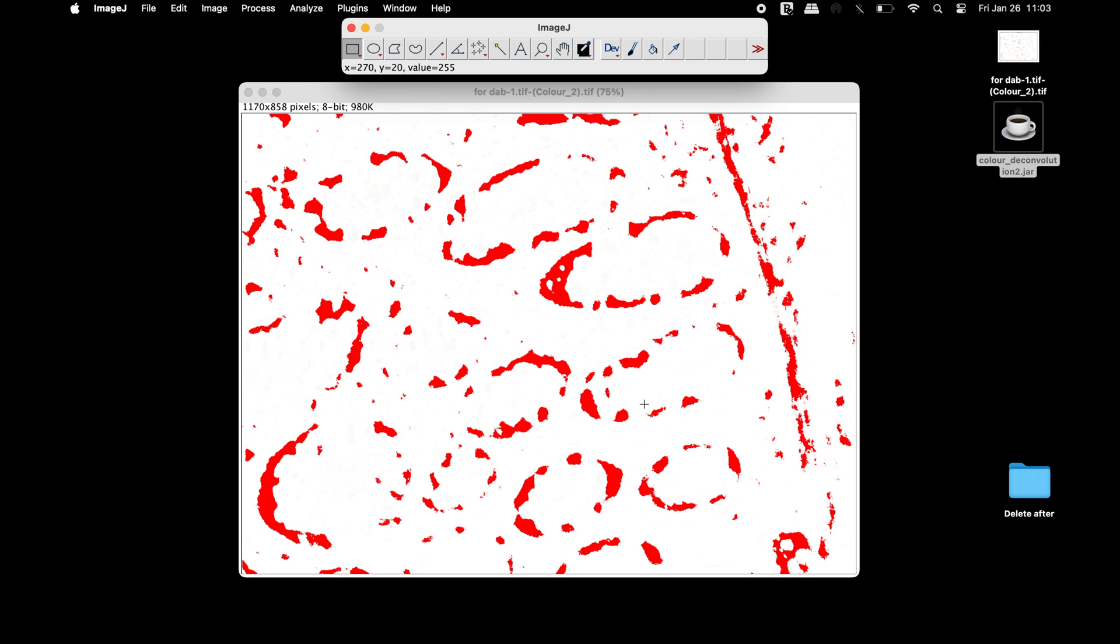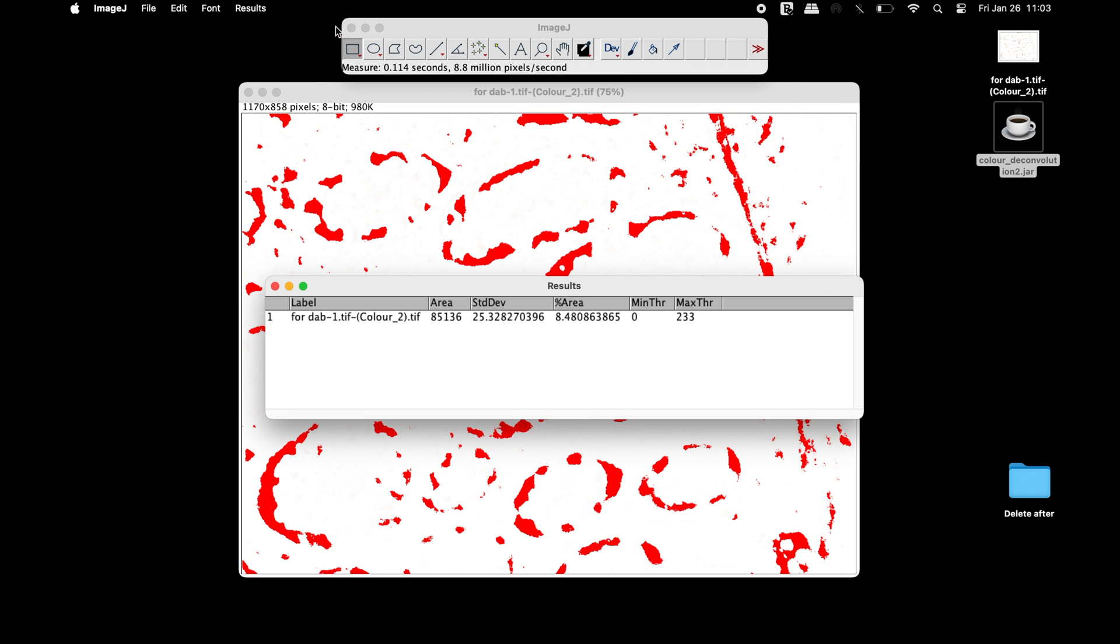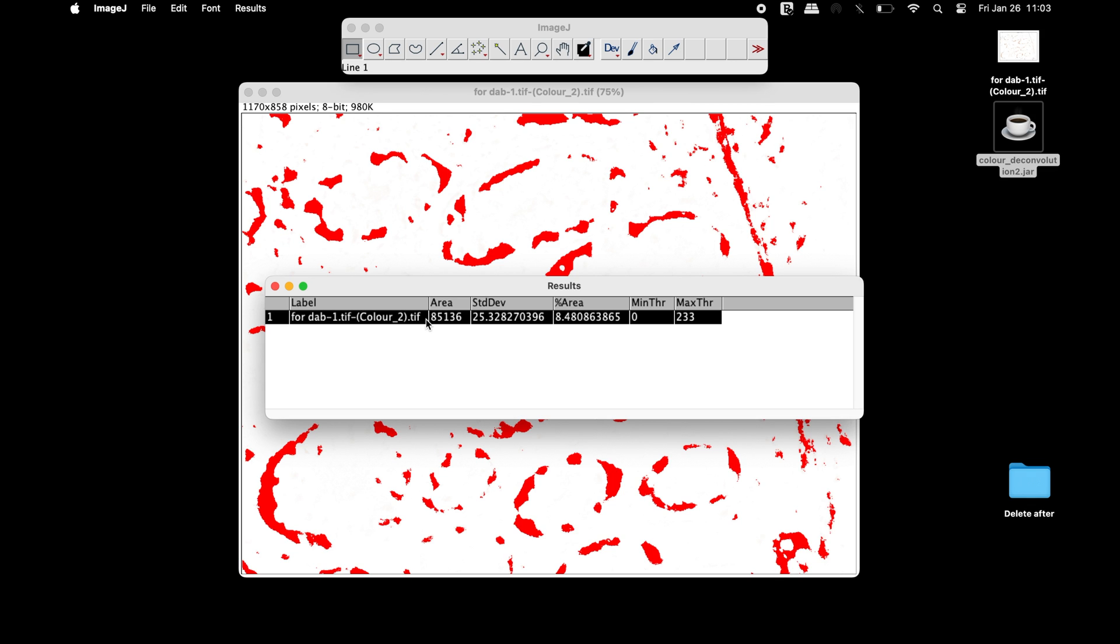Now, click on Analyze and select Measure. In the Results window, users can find information for the total area and the percentage area of the DAB staining.